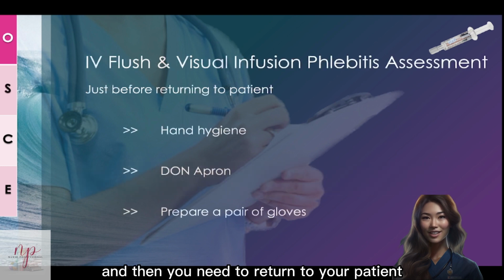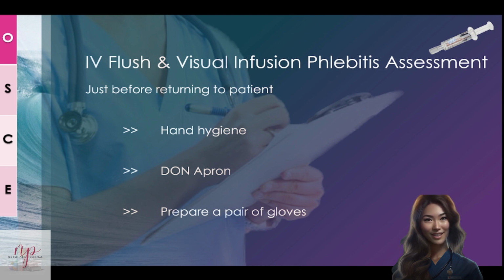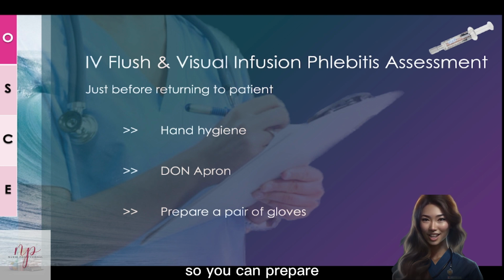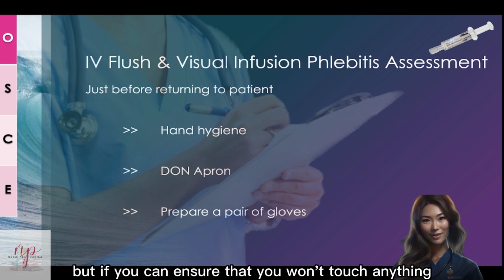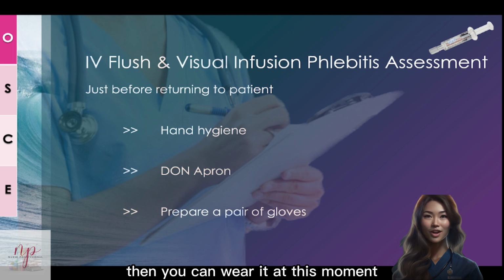And then you need to return to your patients, but please do the hand hygiene first, and then you wear your apron, and then you prepare a pair of gloves. Because you still need to do some arrangements, so you can prepare a pair of gloves and wear it later. But if you can ensure that you won't touch anything and you won't contaminate your gloves, then you can wear it at this moment.